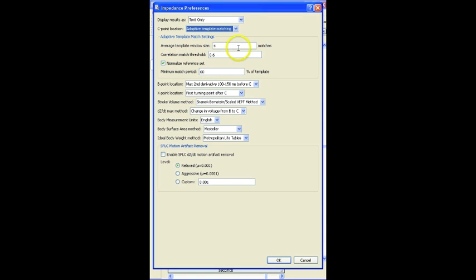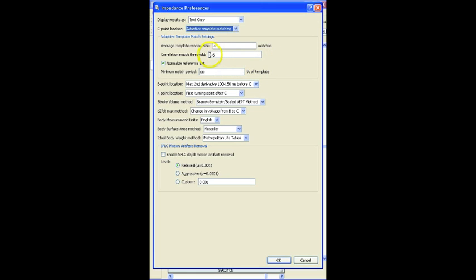And for this adaptive option, there are a number of sub options available. The average template window size, the number of matches that it's looking at as it moves through the data, and then the matching, the percent match and the correlation match to the threshold.